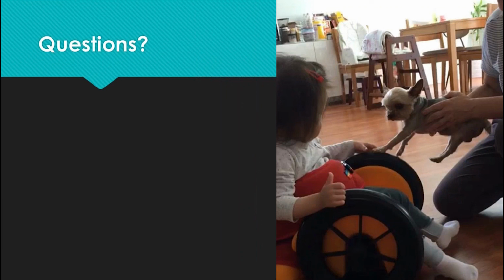One way is this child's parents just left off the footrest, and that made it easier for them to switch back and forth between the crawl and the ride position. So that's one option. If your child doesn't need their feet supported, you can leave that front part off. You'll always find if you're doing something often enough, it always becomes quicker.